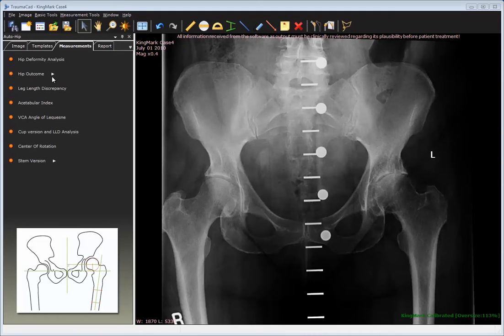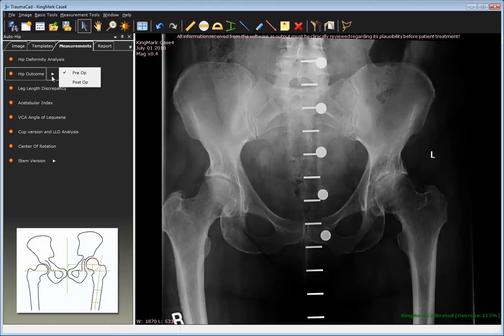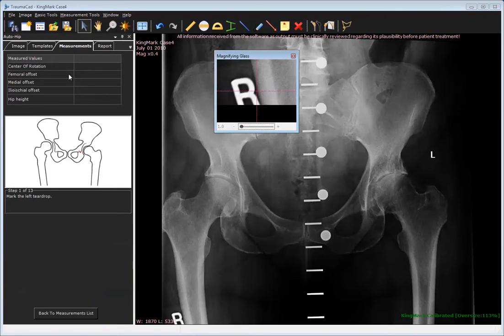Begin by performing the measurement on the pre-operative image. From the Measurements tab, select the Hip Outcome option and then select Pre-Op in the submenu. Follow the steps in the wizard to mark the anatomical landmarks on the image.